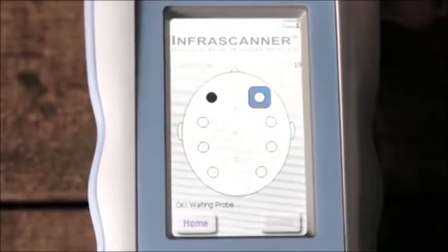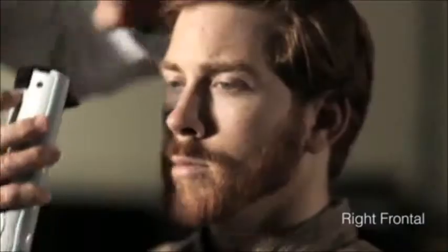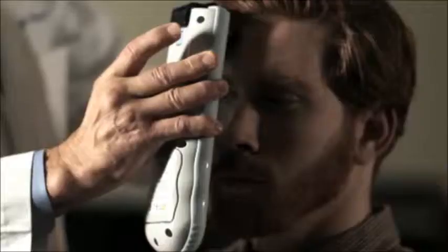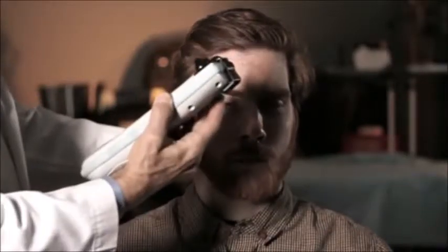The black dot will appear after the first measurement on the left side. Now we're going to go to the opposite side and select a symmetrical point, again in the mid-pupillary line between the hairline, above the frontal sinuses. With firm but not hard pressure, we hear a beep and we now have a symmetrical infrared reading showing green on each side, meaning that there is no hematoma at that level.